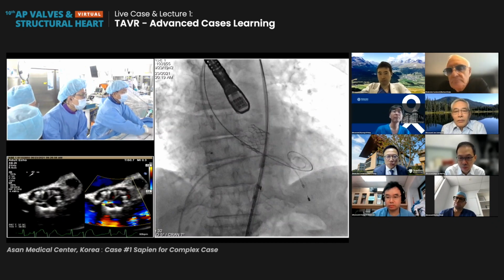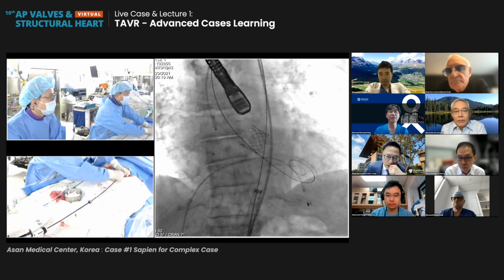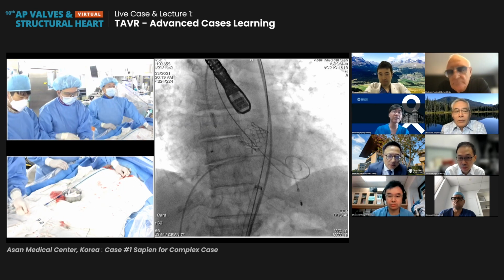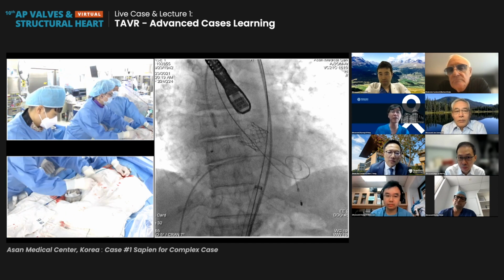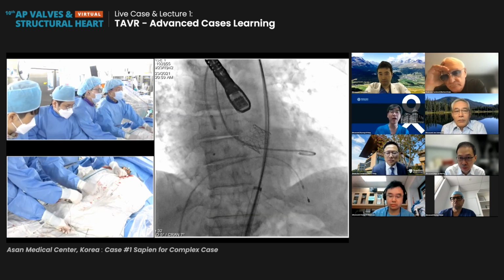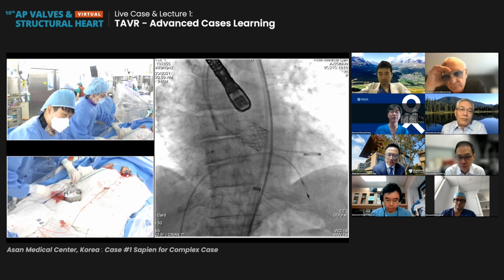And also, we would like to see the simultaneous pressure measurement. All right. Yes. Wires. Personally, I think the technique itself is excellent and perfect, but in the clinical aspect, the patient size is very small. The height is 138 and the body weight is only 40, and therefore you have to choose a very small size of the SAPIEN valve. There is the imaging specialist. I'd like to ask what is the effective orifice area after the TAVI procedure in this patient. Is it possible to measure on-site? Please provide the effective orifice area after the SAPIEN 3 20.